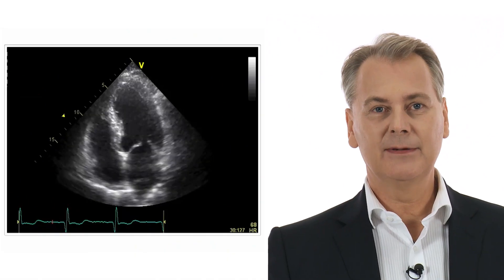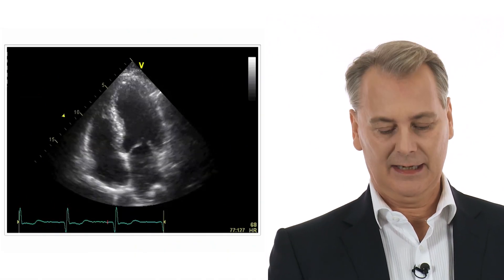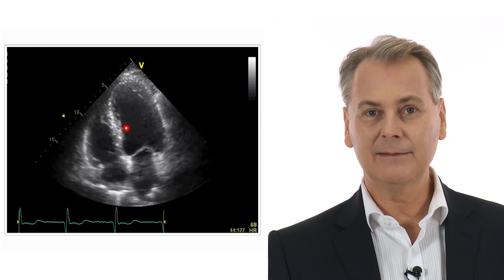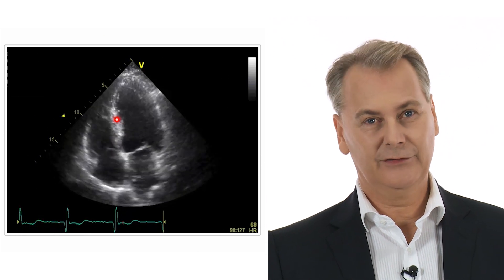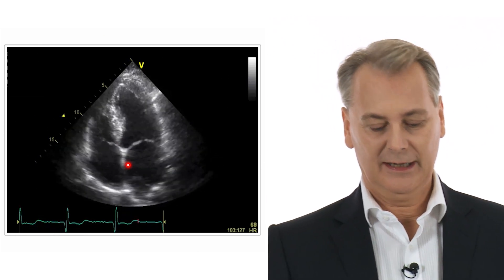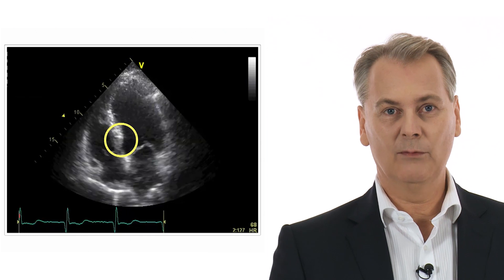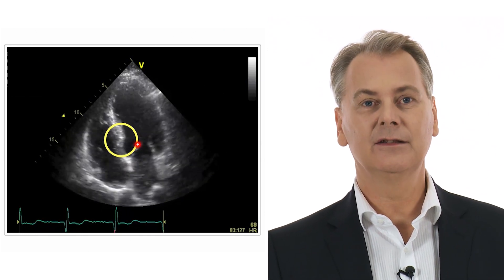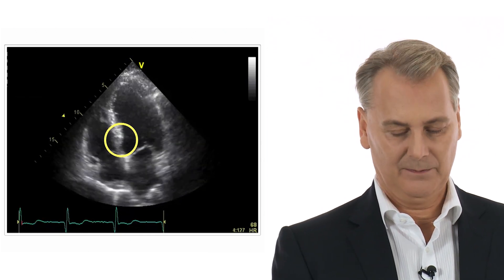The same can be seen here in the four-chamber view. Remember, the basal part of the inferior septum belongs to the right coronary artery, so we expect to see wall-motion abnormalities here, and indeed we do.